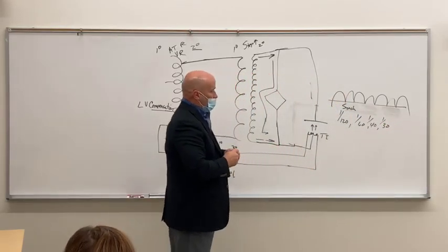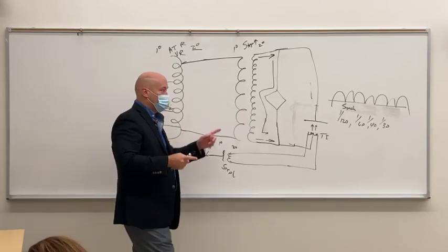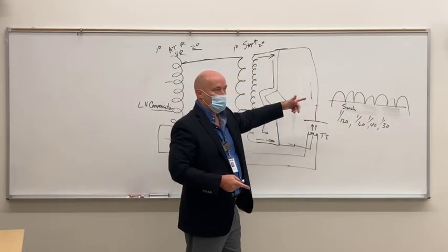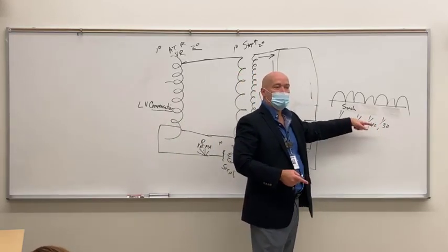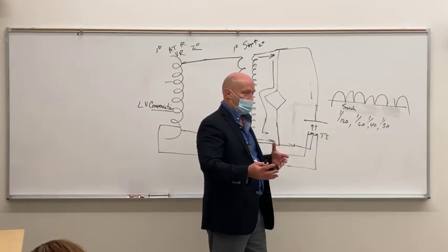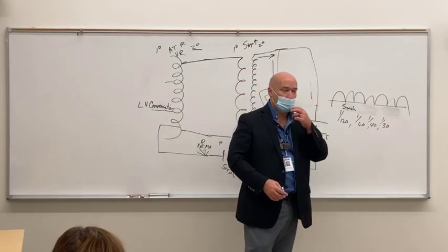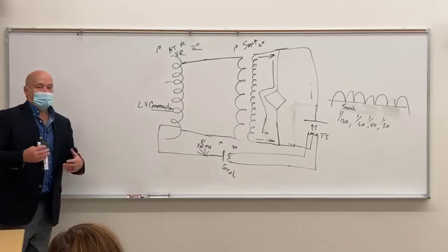So about the only time that you're going to see a synchronous timer, and how you're going to know you're working with single phase equipment, because this only works with single phase equipment, is that you're going to be looking at fractions instead of decimals. Your timer setting is not going to read out in milliseconds, it's going to read out fractions, 1/120th of a second. Okay? So very accurate, but very limited.